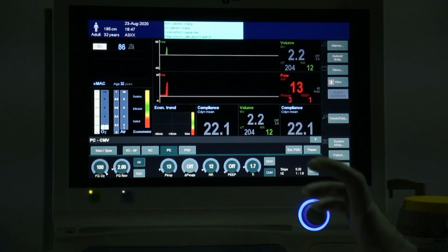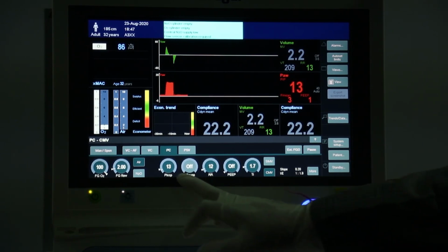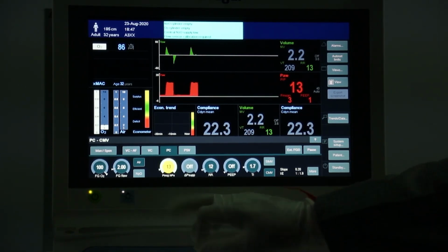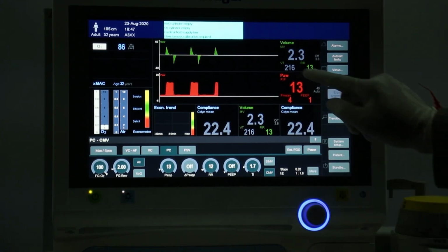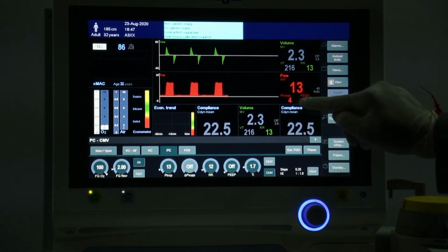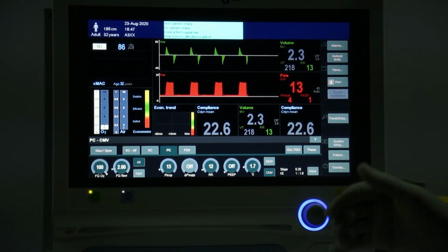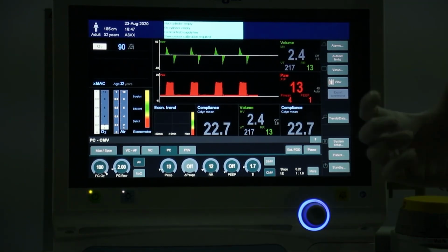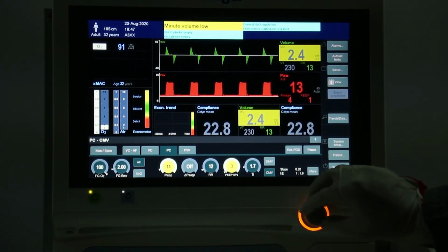Here we are keeping the driving pressure at 13. So, we set our inspiratory pressure in pressure control ventilation at 13, PEEP 0. So, look at this, here plateau minus PEEP is less than 13. So, the advantage of using this machine is that once you increase the PEEP, it keeps the driving pressure the same.